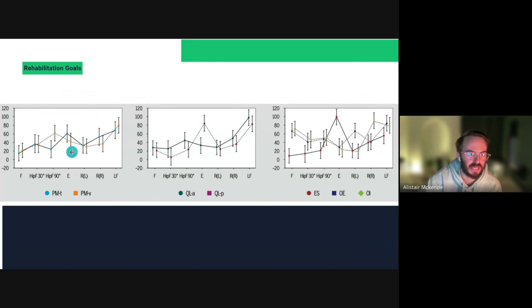And then if we look at the extension test, you can see here that the posterior part reaches about 60%, and the anterior part of the psoas major reaches 40. So together it creates 100% of its contribution at that stage during that extension. And I believe that's to maintain the lordosis and increase the force length of the erectors.